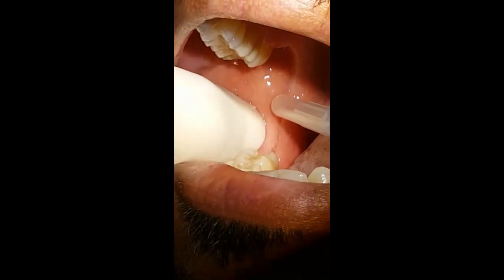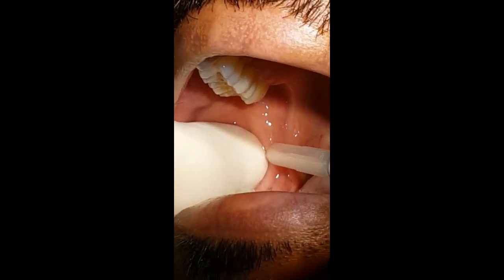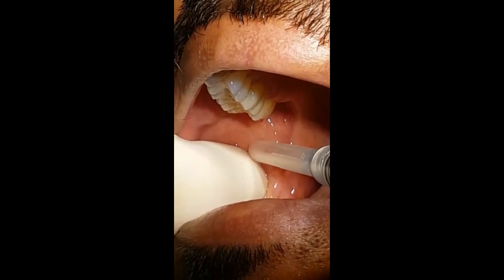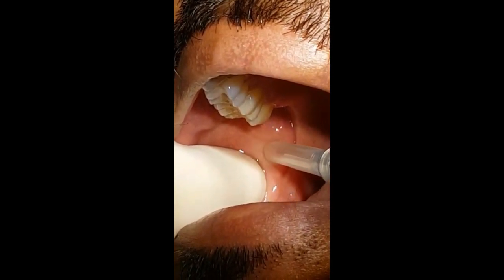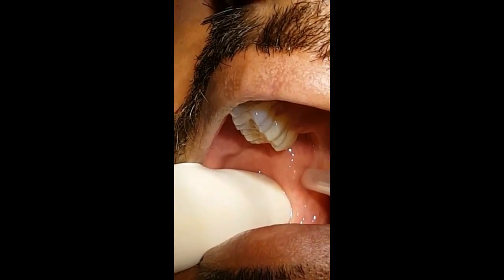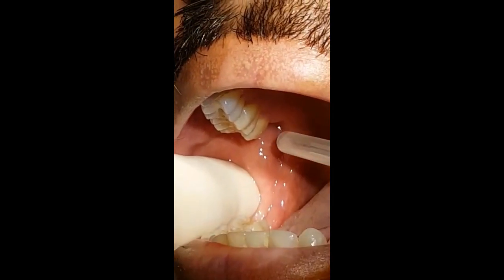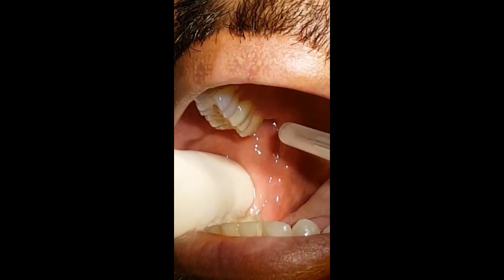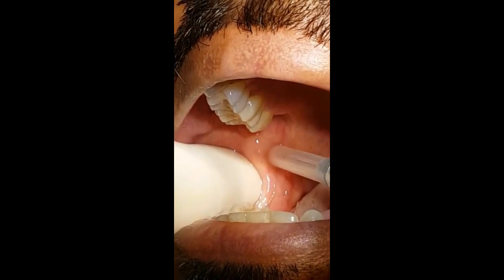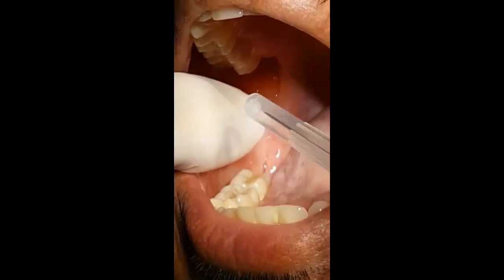In that scenario, my tip number two is: don't take the midpoint of your finger as the height of the injection — take the highest point of the finger. Draw a straight line from the highest point to the pterygomandibular raphe. The point of entry is lateral to the raphe, coming from the opposite side, bisecting the premolars or near the corner of the mouth.